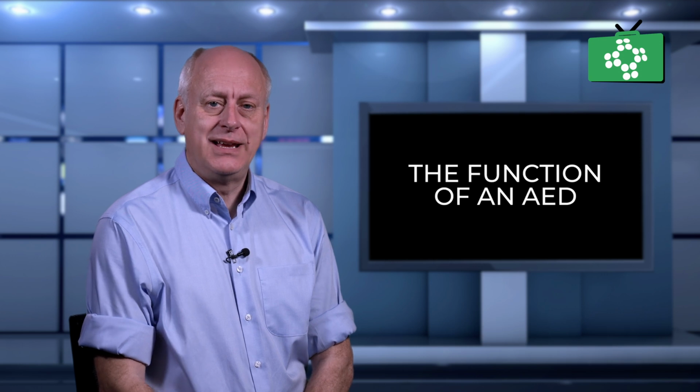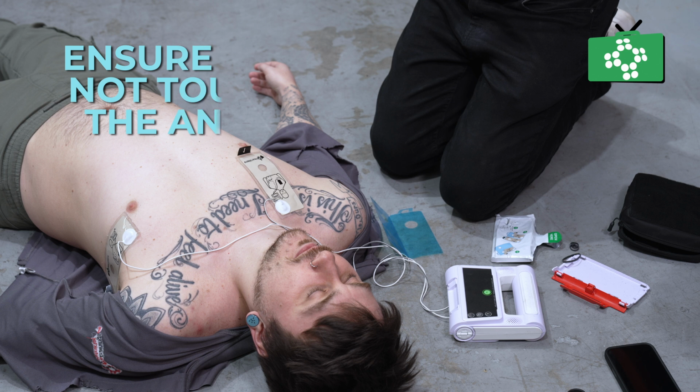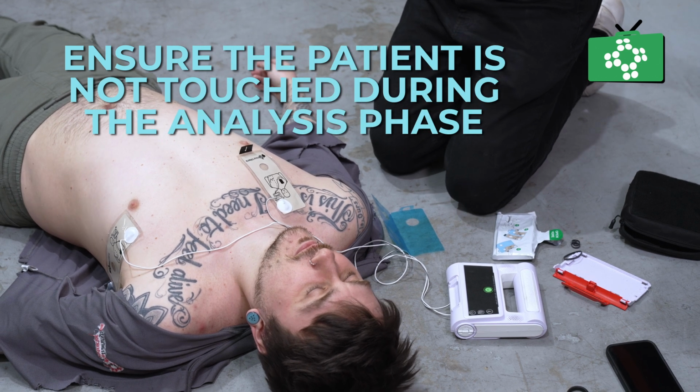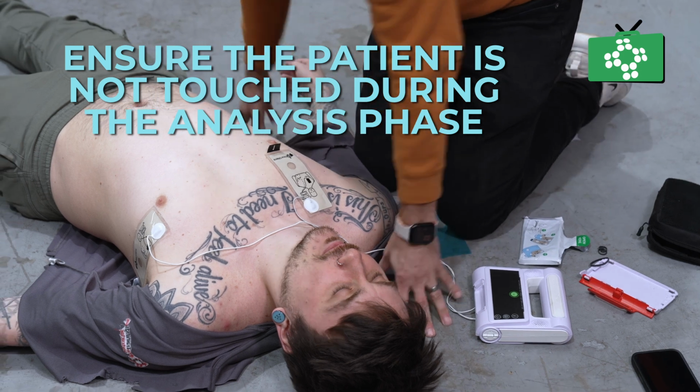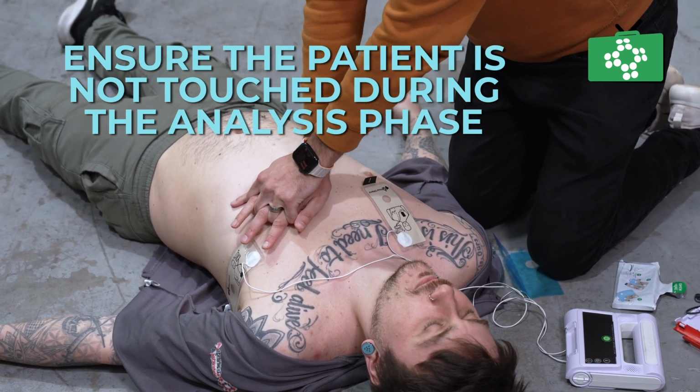During the analysis phase, it's very important that nobody touches the casualty. Movement or pressure on the chest can interfere with the AED's ability to accurately read the heart rhythm. This is why the device will instruct rescuers to stand clear while the analysis is taking place.